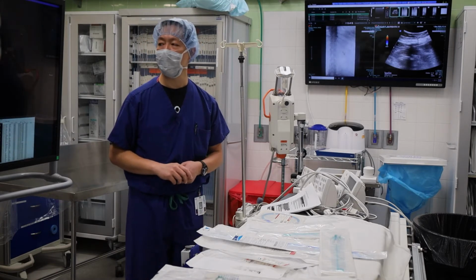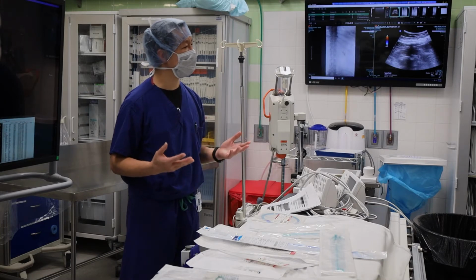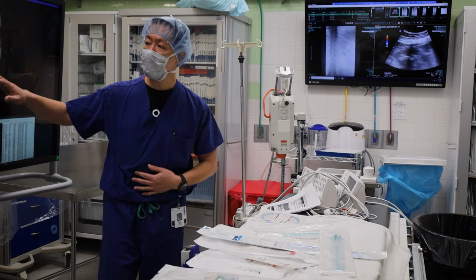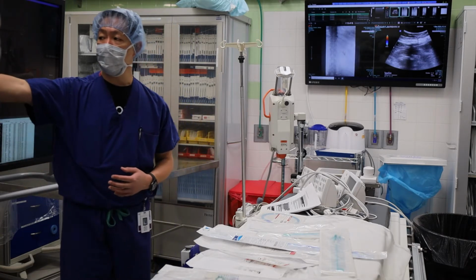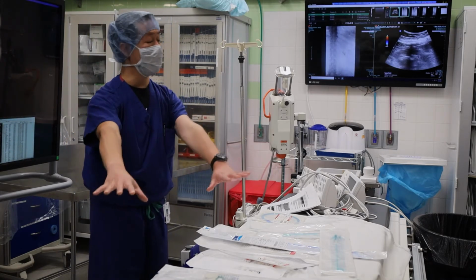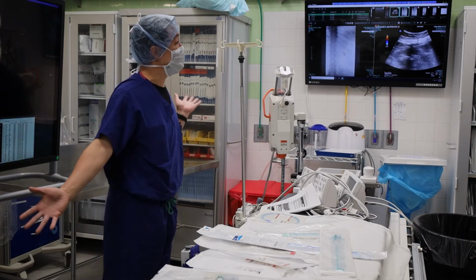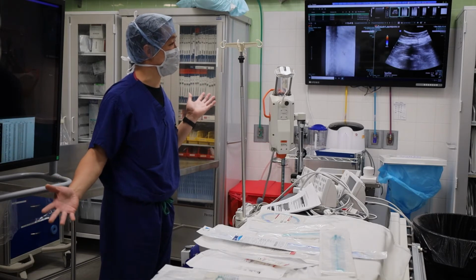Sometimes hard to tell, right? If you've got more ribs, you'd be like, it's not even a kidney. Ultrasound is just tricky. And so, again, we cheated. We looked at the CT, so we know where the stone is. And then luckily on fluoro, you can see a stone. Okay, now, so this case is different than the last case. The last case was all obstructed. Our imaginary patient was all obstructed. These often are not obstructed, they just have a big stone. So now you're trying to stick into a non-dilated system, which is very interesting, right?